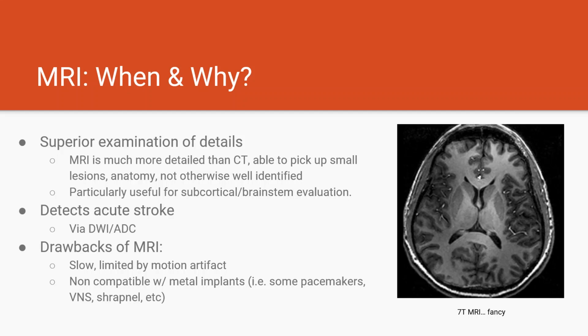The drawbacks of MRI, of course, are that it's a slow test. It isn't the best in emergent situations. And then also it's non-compatible with metal implants. And like I said, we run into this issue a lot, mostly when we're trying to scan patients who have pacemakers.